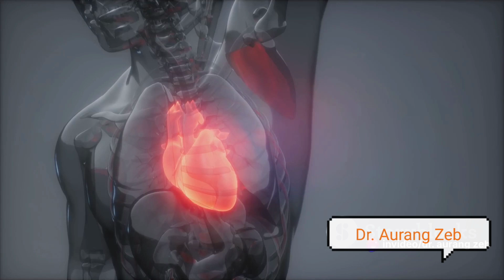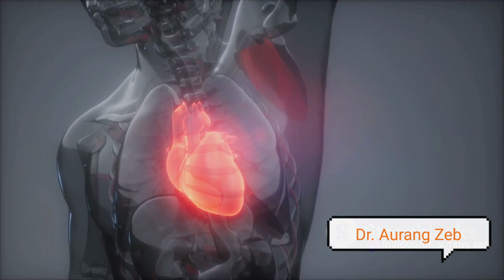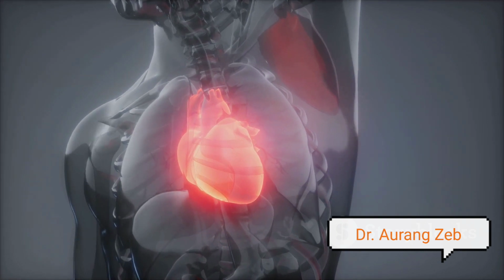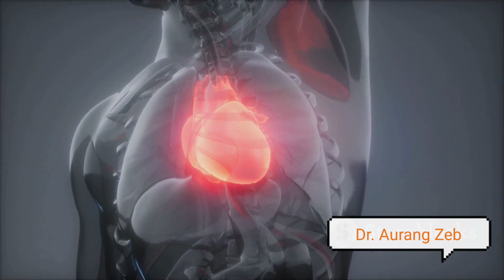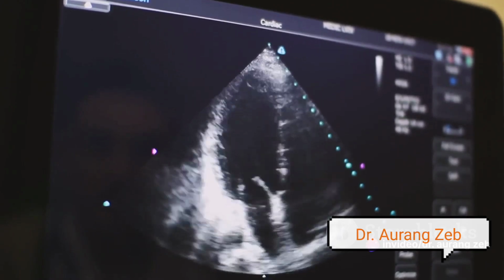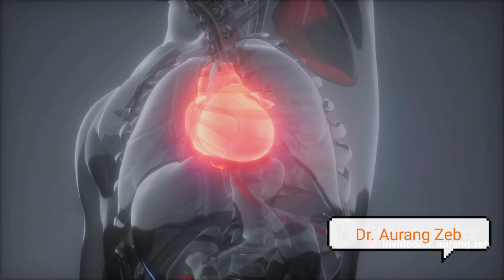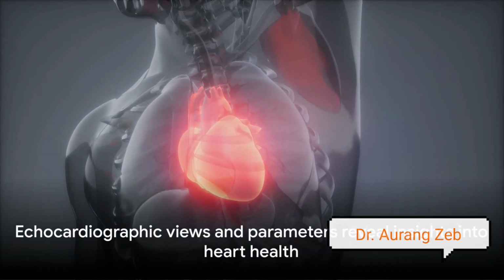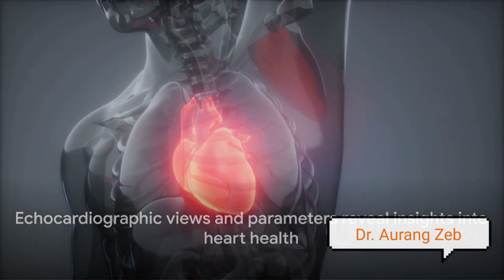In summary, each echocardiographic view offers a unique perspective of the heart and its components. By recording specific parameters, we gain a comprehensive understanding of the heart's structure and function. This information helps us identify abnormalities and monitor the progress of heart disease. These views and parameters provide a wealth of information about the heart's structure and function.